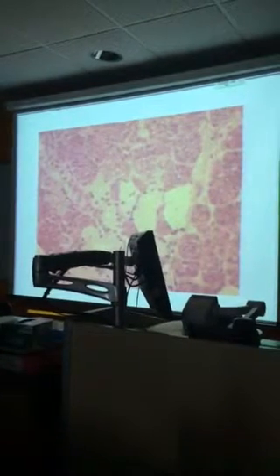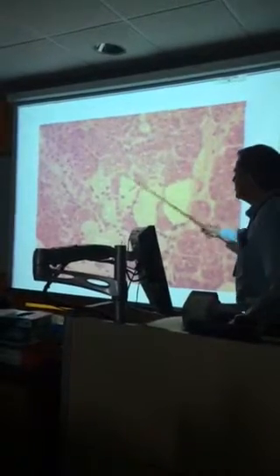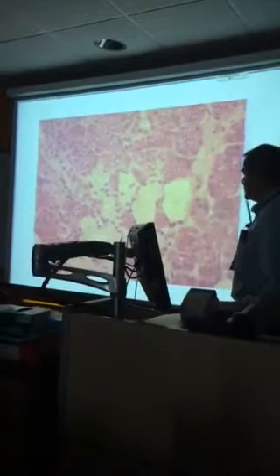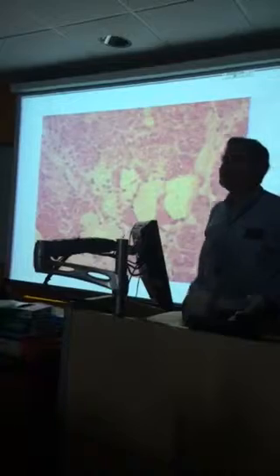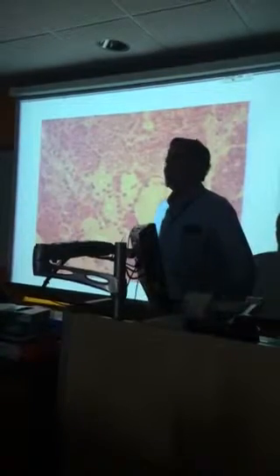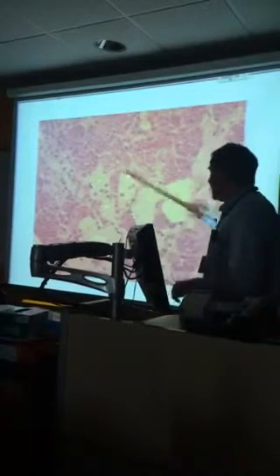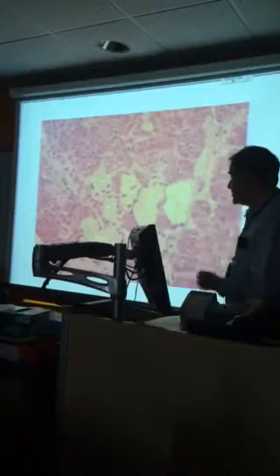Something else you'll often see is a group of mucus cells capped with serous cells. Typically the serous cells form a crescent. This is called a serous demilune. It's on your handout. Lune, as in lunar, like a moon. Almost like a crescent moon, like a first quarter or last quarter phase of the moon.